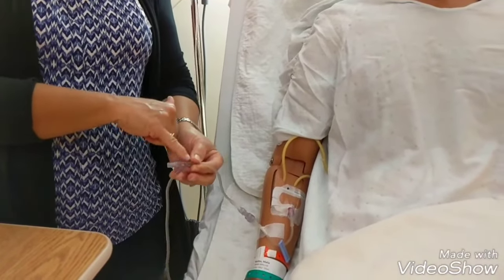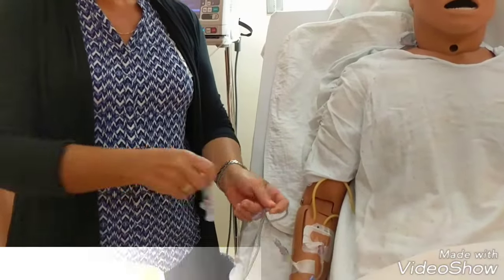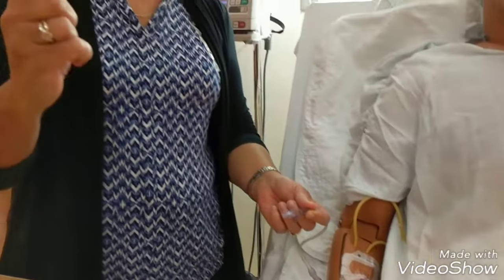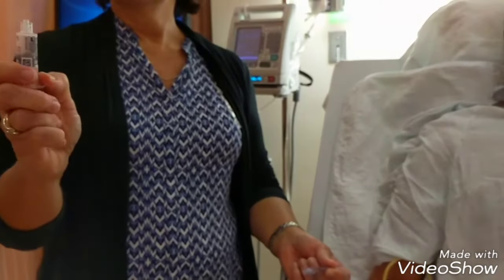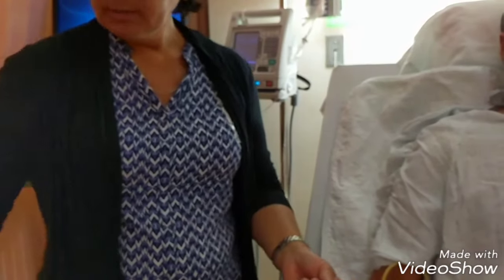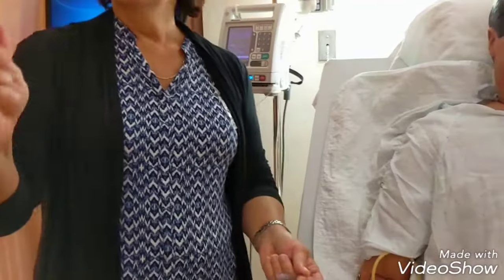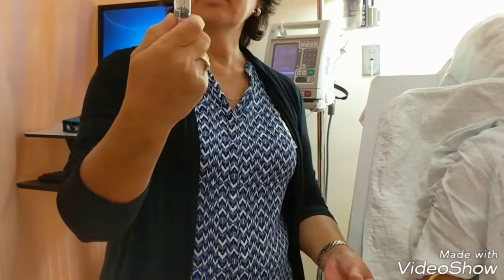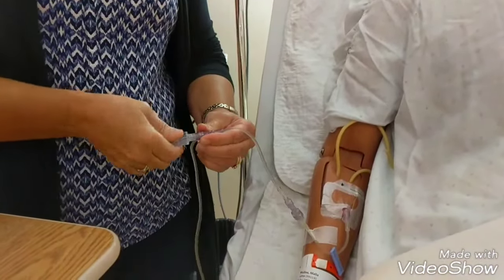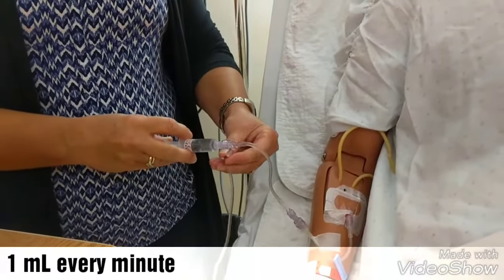Now I'm going to flush it to make sure I get all the medication out of this port. I'm going to use a 3ml pre-filled syringe. I'm going to take off the top — always pull back and make sure you get all the air out so you're not injecting any air. This one is totally empty, so let's try another one. This is why we get the air out of the syringe — pull back and make sure you have no air in your syringe.